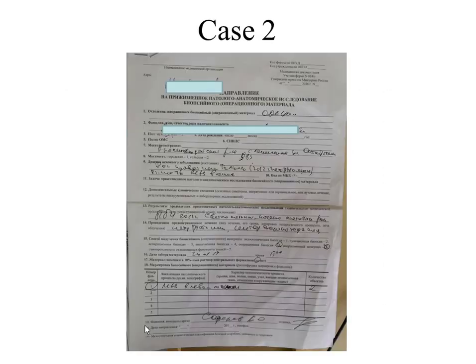Next example, case number 2. Patient with a nodular formation in the left lung. In anamnesis, we know that this patient had cancer of the right kidney in 2012. So 7 years ago, this patient had a cancer of the kidney. According to TNM, that tumor was T2 N0 M0.